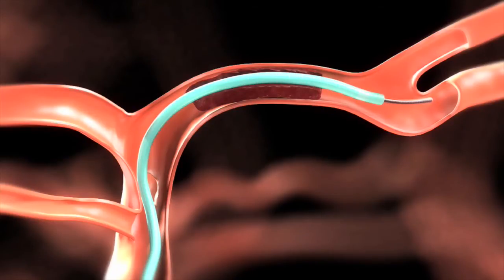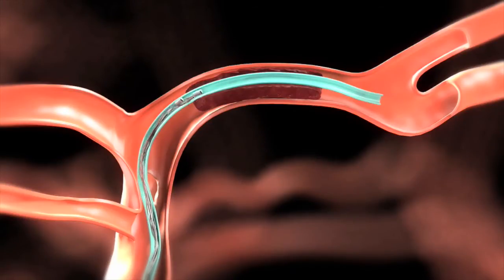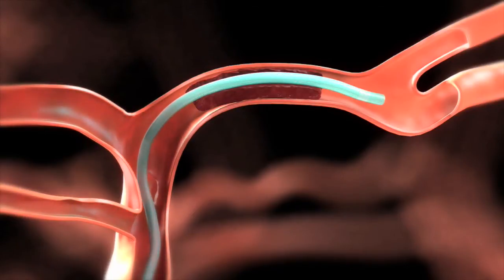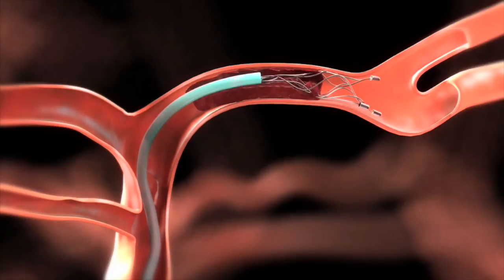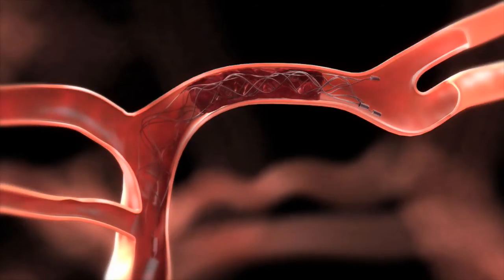Once we're across the blockage, we bring up a mechanical thrombectomy device, which is kind of a stent-on-a-stick configuration. It's a stent-like device that we unsheathe within the clot in the blockage. You can see the stent is opening up and actually restoring blood flow immediately. We then give it about five minutes, allowing the radial force of the stent to open up outward and allowing the clot to extrude within the lumen or inside of the stent.